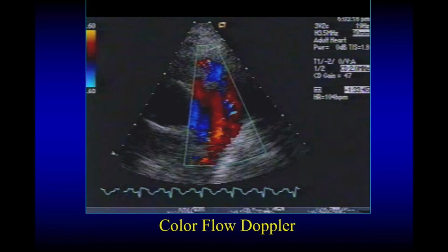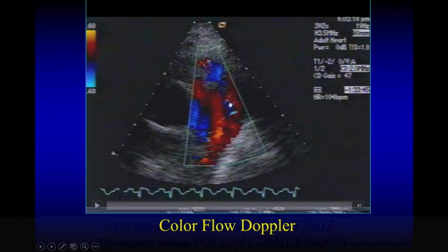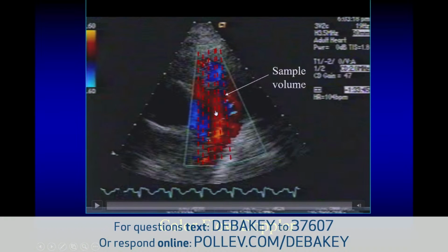Color Doppler is, in a way, a pulse Doppler technology, but there's not enough time to be able to resolve a fast Fourier transform. So we have an estimation of what the velocity shift is at these tiny little windows, and therefore we can tag them with a direction: coming towards me is more red-yellow, going away from the transducer is bluish.